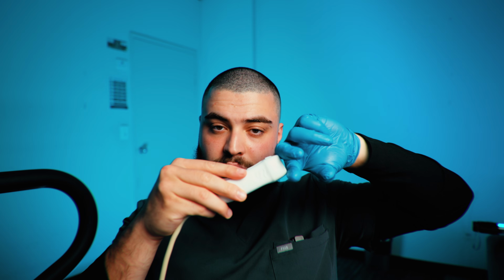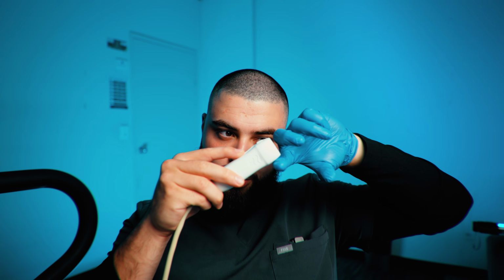Remember, these are the ribs, and this is the ultrasound probe for your 4-chamber. When you go to your 2-chamber, the ribs are going to block the ultrasound path. So one thing you can always do is just pull down on that rib. Not hard, but just enough to help the ultrasound pass through. And a lot of the time, you're going to see that dropout clear up, and you'll have better wall definition, as we saw with the anterior wall as well.